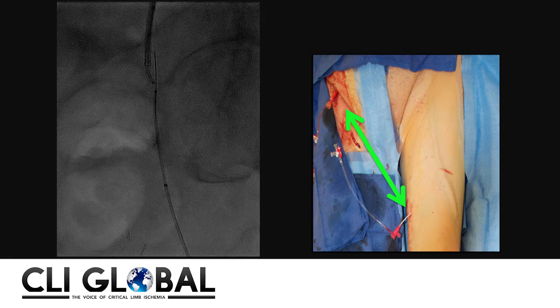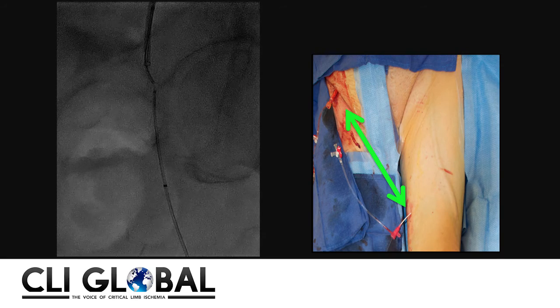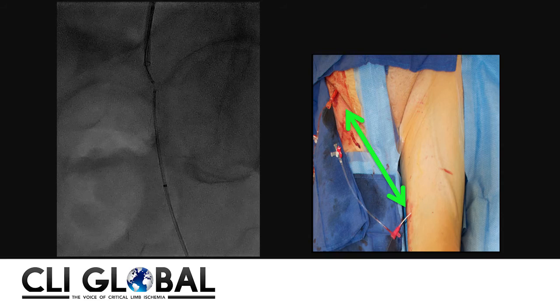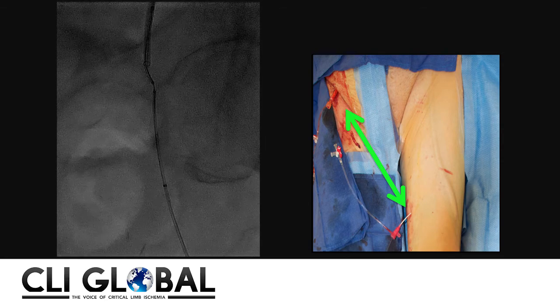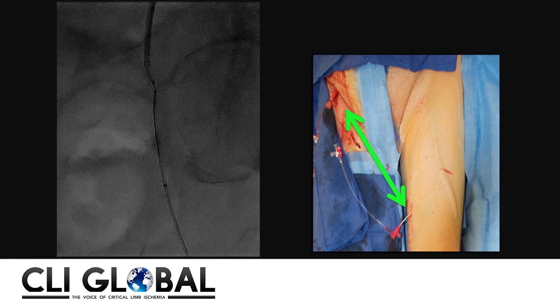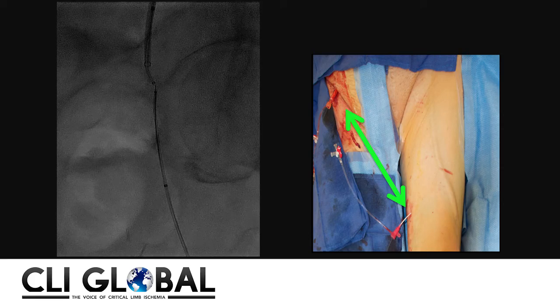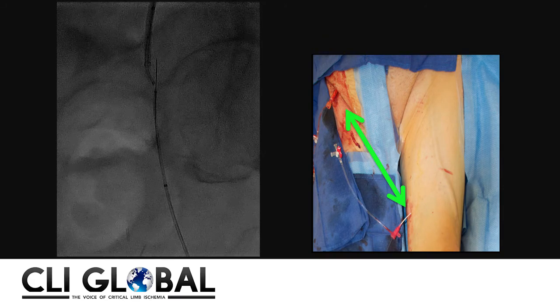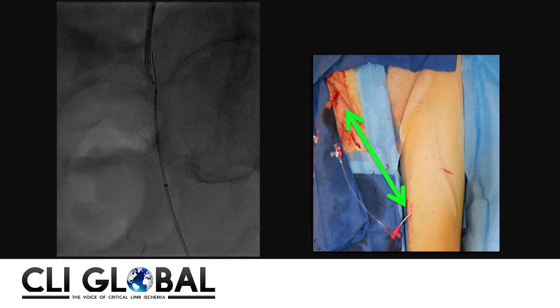The Navicross catheter is being advanced in a retrograde fashion from the occluded segment of the distal left superficial femoral artery, while another Navicross catheter is advanced from the contralateral right common femoral artery. We are advancing an 0.014 Command wire from one Navicross catheter to the other — what we describe as a tunneling technique. Essentially, we connected the right common femoral artery 7 French Destination Pinnacle sheath to the 4 French superficial femoral artery sheath inserted in the distal left SFA occluded vessel, and we were able to floss a wire from the right common femoral artery to the left SFA access.